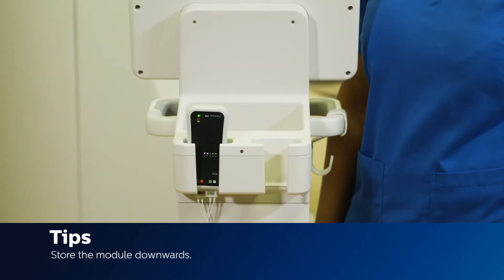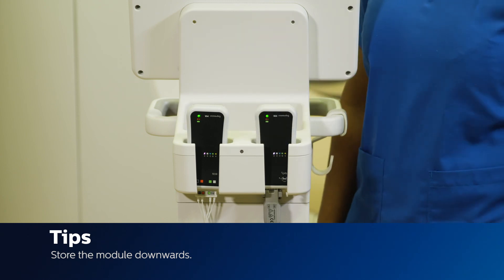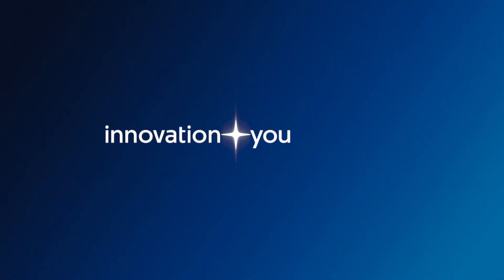When storing the module after the case, make sure to store it downwards where the probe is hanging. Storing it upwards will stress the probe and eventually break it.